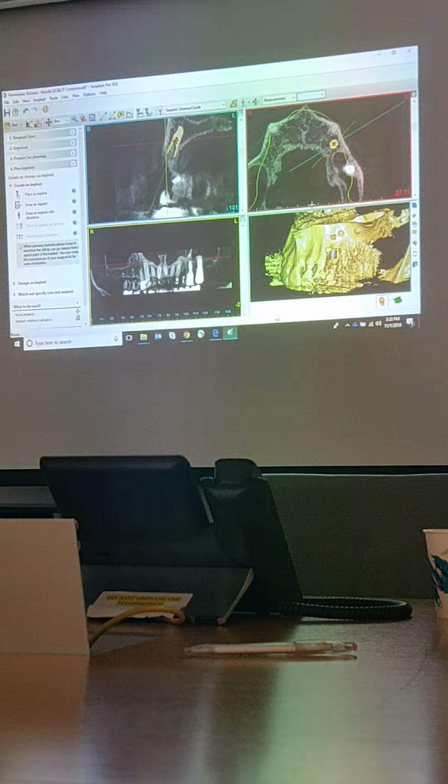We are sending them a radiographic stent that they're supposed to put on in order to see what we think the crown should be. I can incorporate in my guide a radiographic stent with a lift in an area where I want those 7 to 8 millimeter openings.